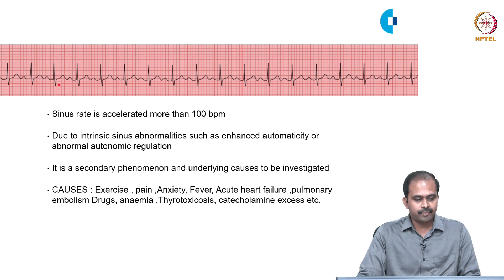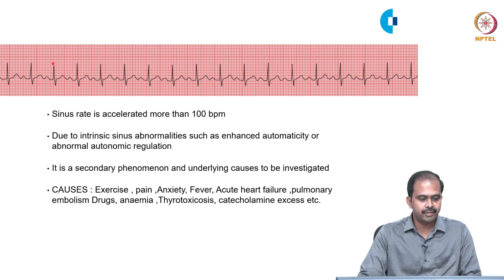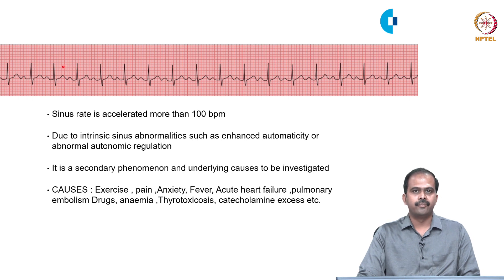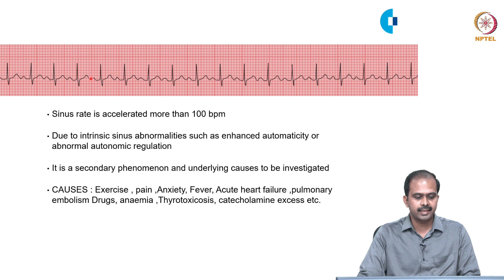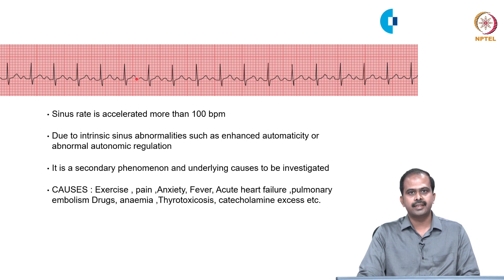In this ECG, let us calculate the rate. Between two R waves there are approximately 10 small boxes; using 1500 divided by 10 equals 150. The rate is more than 100, so it is tachycardia. A P wave precedes each QRS complex followed by a T wave, confirming sinus origin. This is an example of sinus tachycardia.